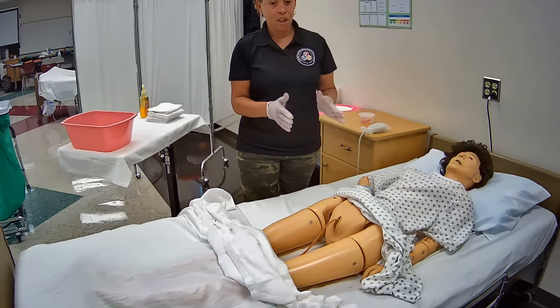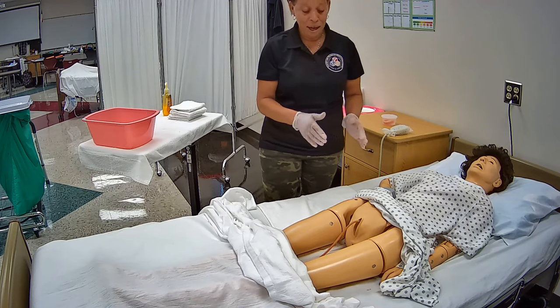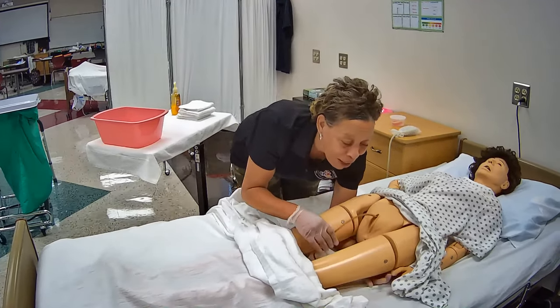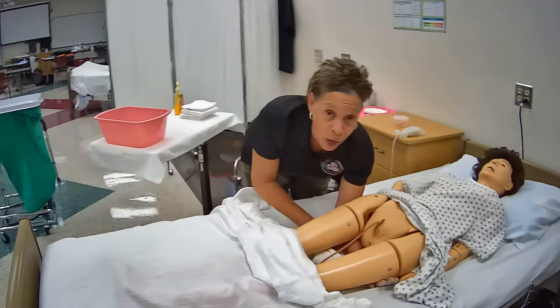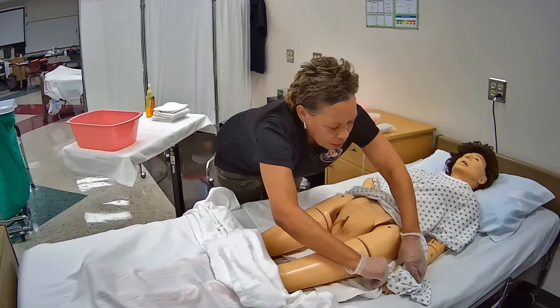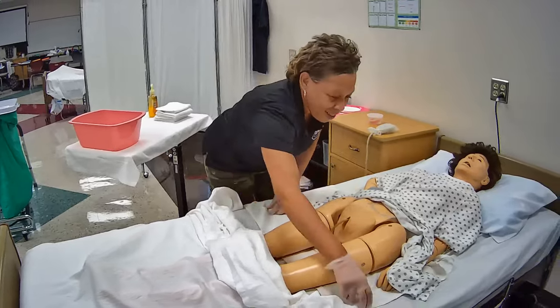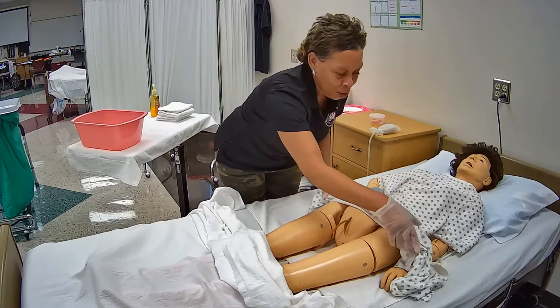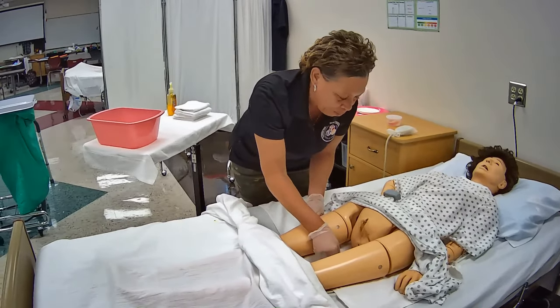Mrs. Jones, I'm going to place the linen protector now. I'm going to roll the towel just a little bit and situate it on the bed. When you place the linen protector, make sure it is completely underneath the person's buttocks. If the NAE starts walking toward you, it might be a good idea to recheck. On the count of three, I'm going to ask you to raise your hips. I'm putting my arm underneath both legs close up on the thigh area. One, two, three — and lift. I'm pulling it through, making sure I have it completely underneath your buttocks. Now I'm repositioning your sheet and gown to make sure I do not overexpose you.